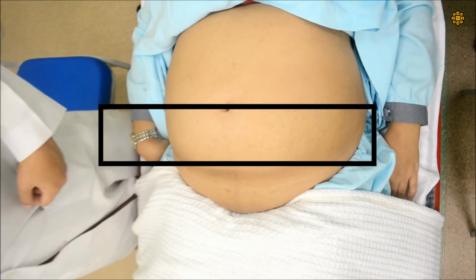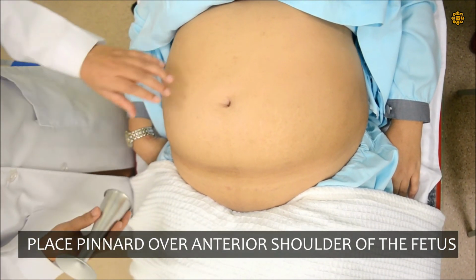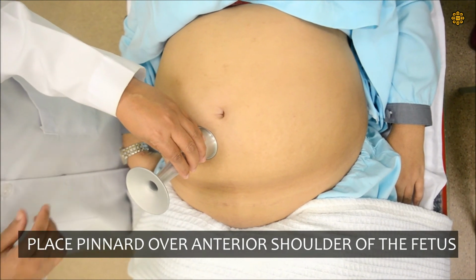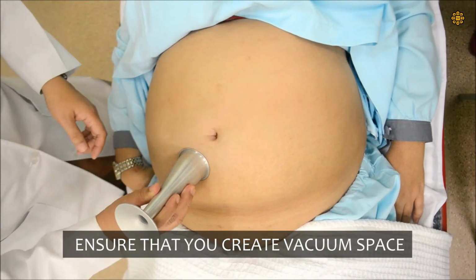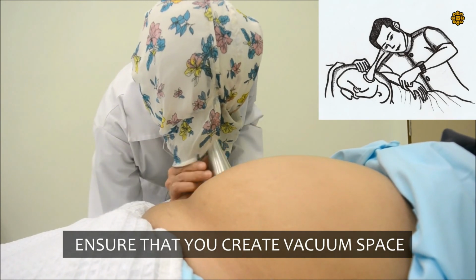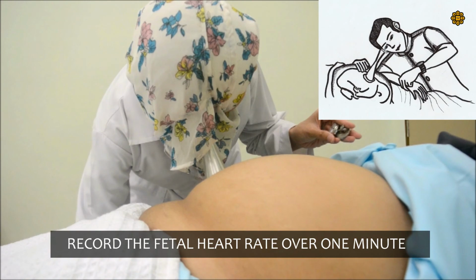Auscultation. Complete your examination by listening to the fetal heart via a Pinard stethoscope using your best ear. This should be done over the anterior shoulder of the fetus. Ensure that you create a vacuum space between the abdomen, Pinard, and your ear to help better sound transmission. You can time the fetal heart rate manually using a clock watch.